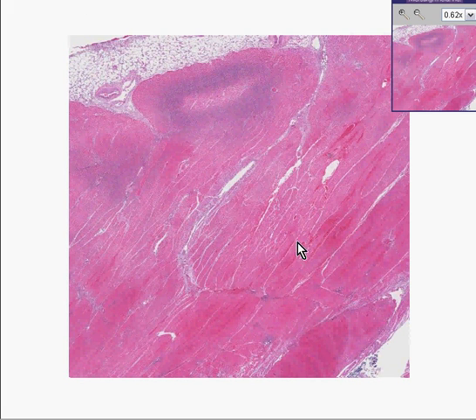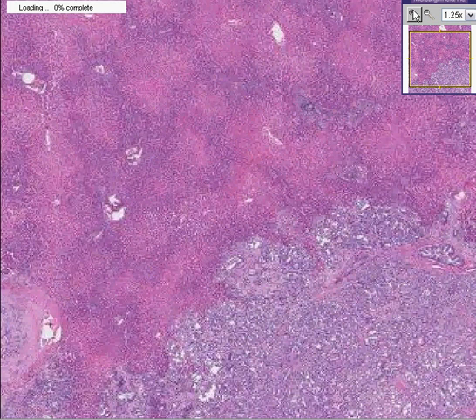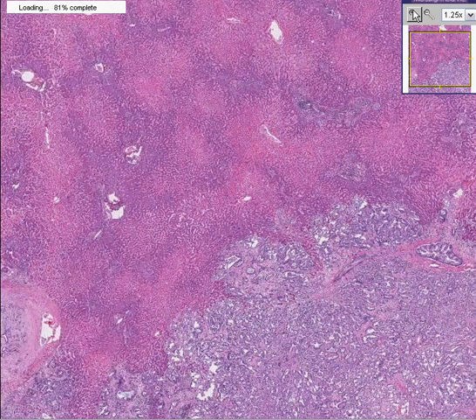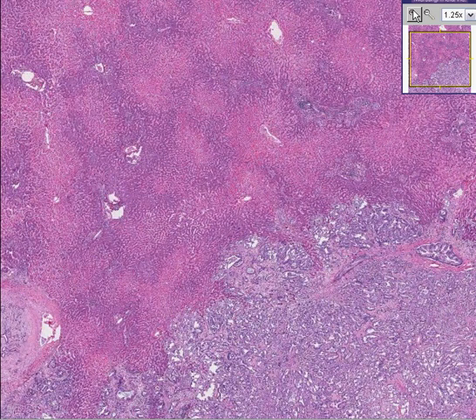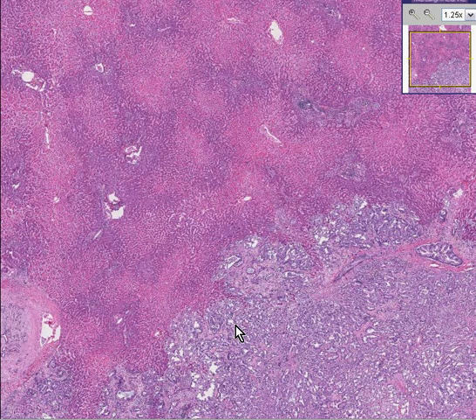And we have a liver which is not only congested, but we see a big cancer of the pancreas pushing into it. To put this whole case together, let's just understand that in carcinoma of the pancreas, as well as several other adenocarcinomas, but most notoriously in carcinoma of the pancreas, there are substances present in the carcinoma that predispose to thrombosis and infarction. And that's how we put this whole case together. Thank you very much.